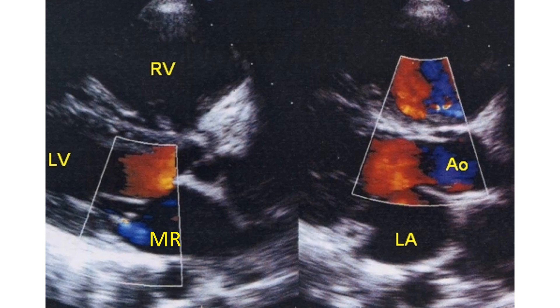Dilated right ventricle is seen on parasternal long axis view on 2-dimensional echocardiography with colour Doppler imaging. Structures labeled include LA (left atrium) and AO (aorta). There is a trivial mitral regurgitation jet seen in the left atrium as a blue jet in the left frame, with the mitral valve in closed position, which is of no practical significance.